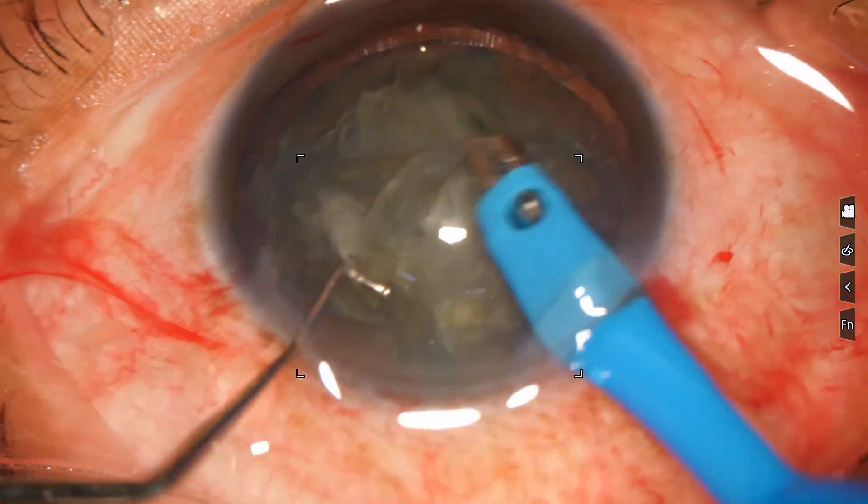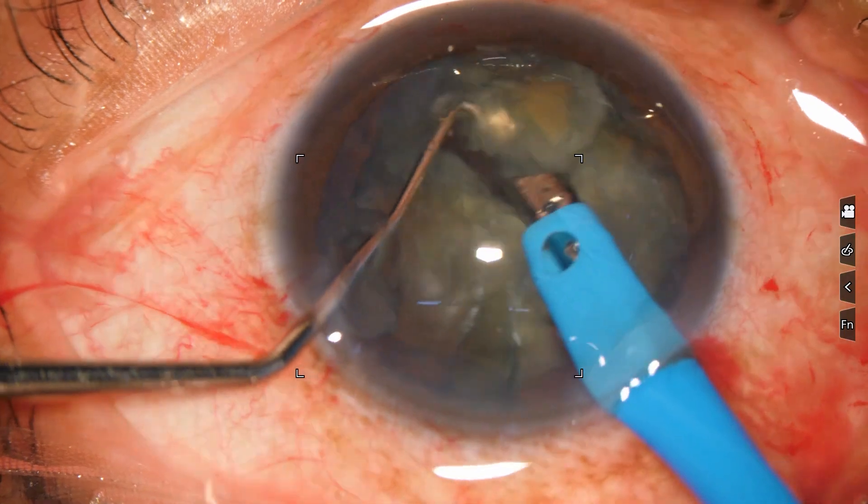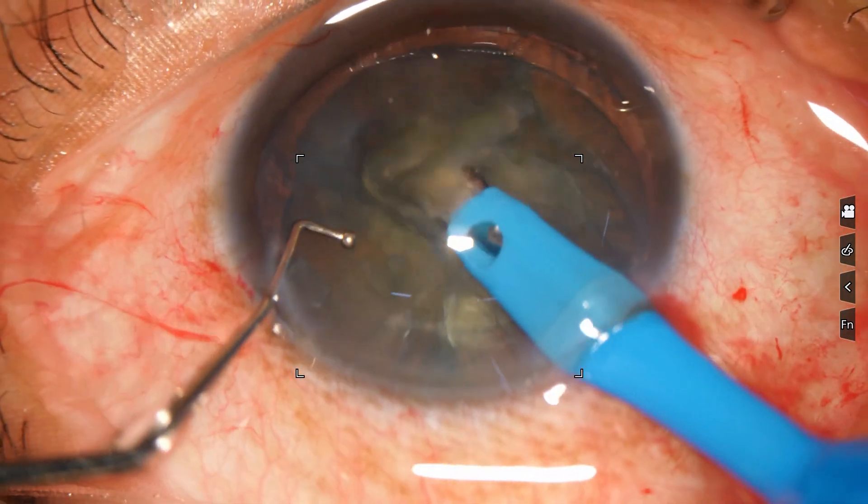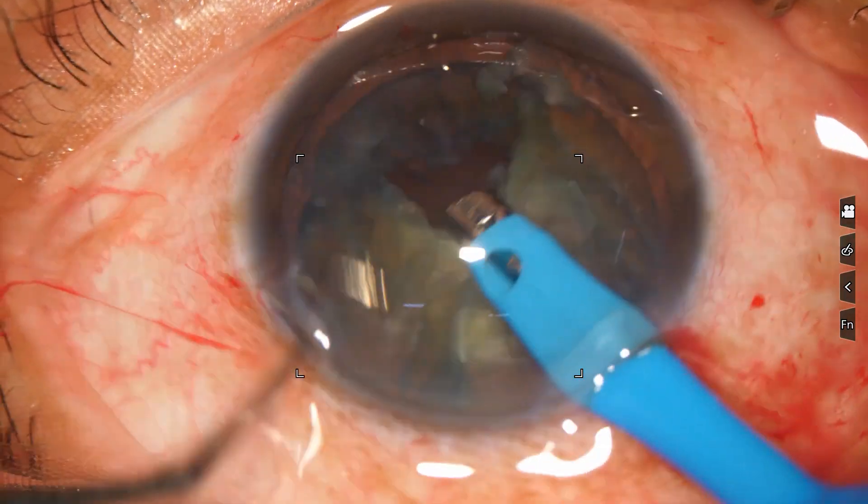But in soft cataract, this is an instrument of great help.